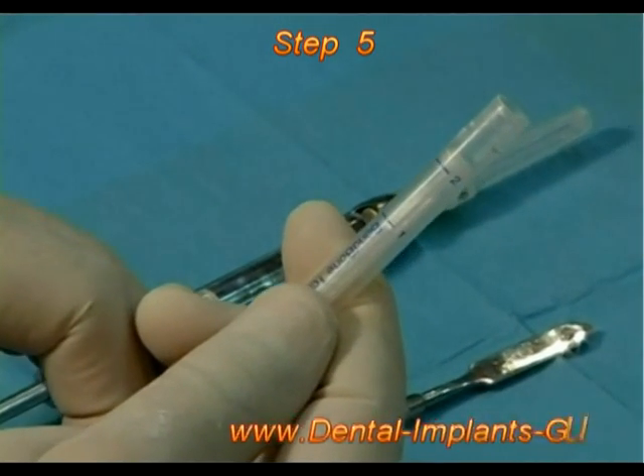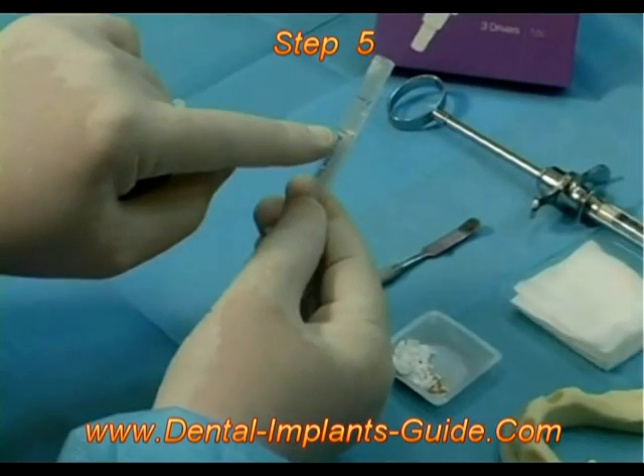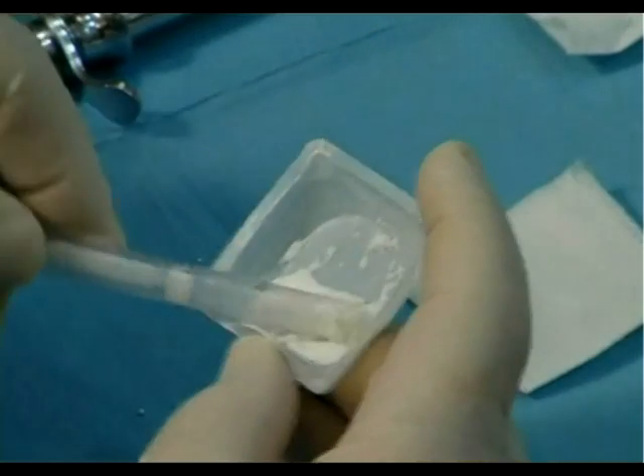Step 5: Use the empty Bond Bone driver as a carrier for the putty by drawing the piston to line 1 marked on the driver, and reload it with the putty.